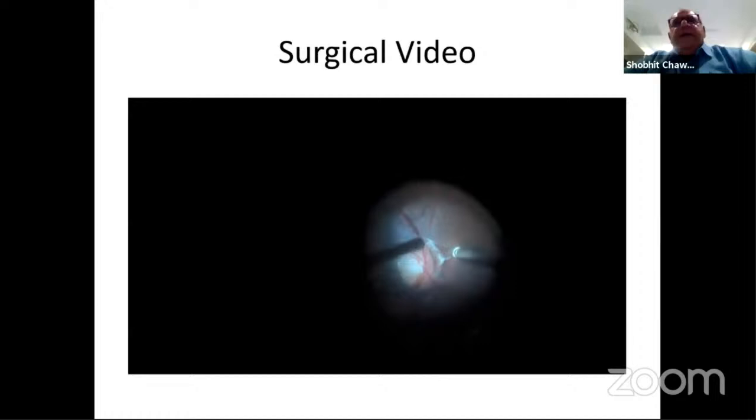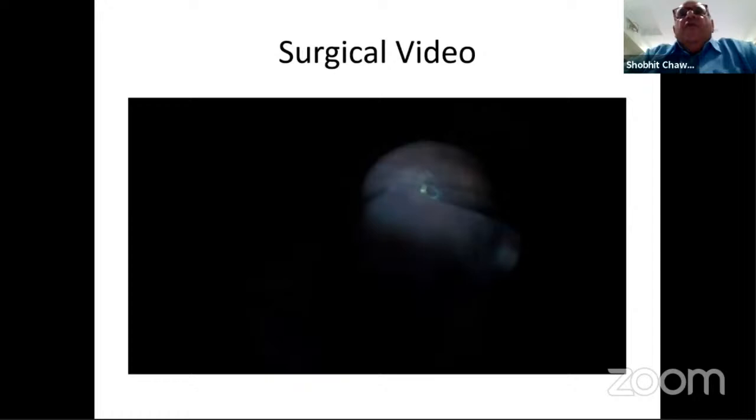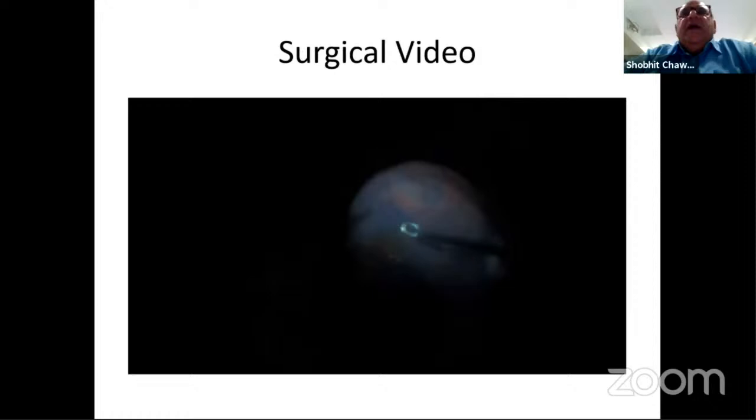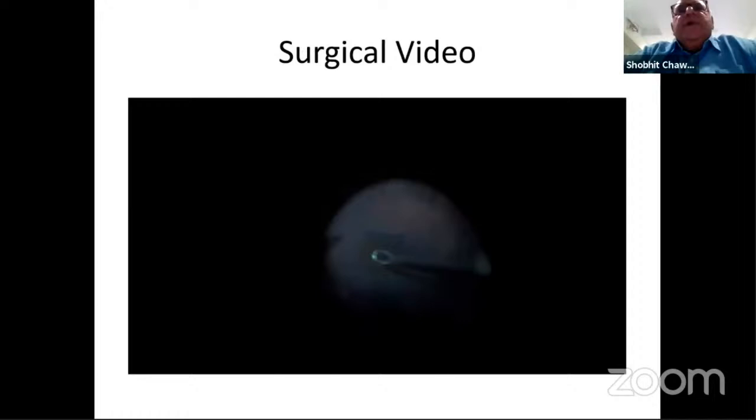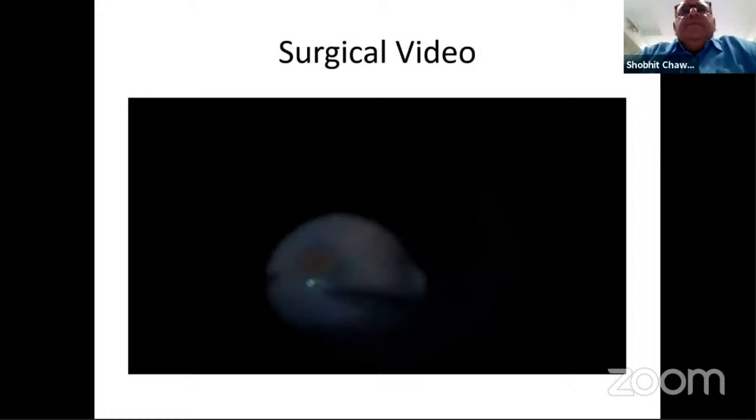I not only do a fovea sparing peel, but I also fortify the weak fovea here with four flaps. It's the envelope technique as advocated by Professor Hassan Mortada from Cairo. So one flap comes on top. I widen the peel, of course, to relieve all tractions. As you can see, the temporal aspect had the maximal traction. So this is my second flap.